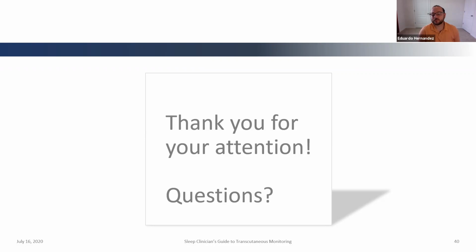Some comments: our lab started with 2 and now we have 5 units that we move around as needed. TCCO2 has definitely added to the quality of our studies and the ability to monitor patients accurately. Thanks for that feedback. We see that in a lot of places. They'll start out with a couple and eventually they'll have 1 at every bedside. One thing that Eduardo brought up, which I think is pertinent, is if you are moving monitors from room to room, we would advise that you do that little analog calibration to make sure that the numbers on your monitor are displaying on your montage correctly. It's an easy, couple of steps to do that. So just keep that in mind, that if you are moving them, you ought to do the analog calibration with the montage.